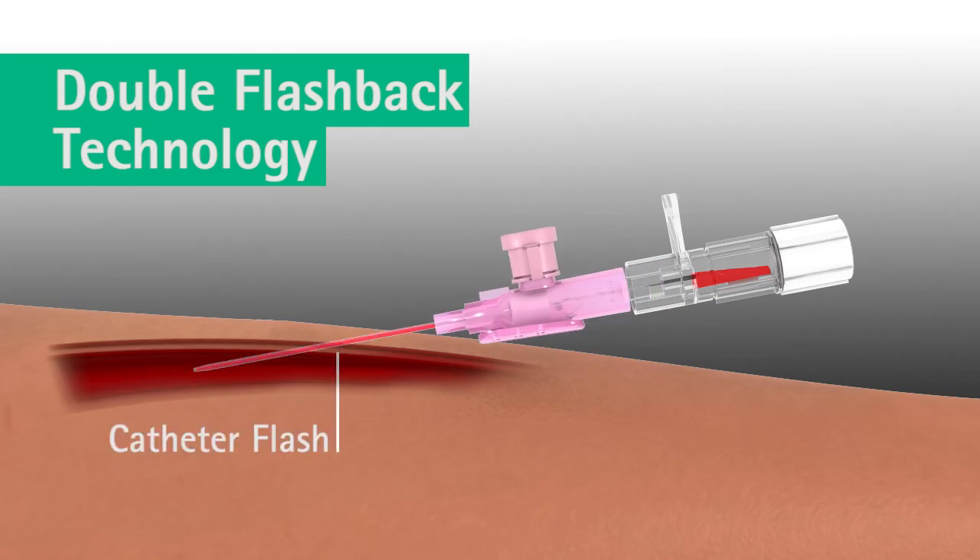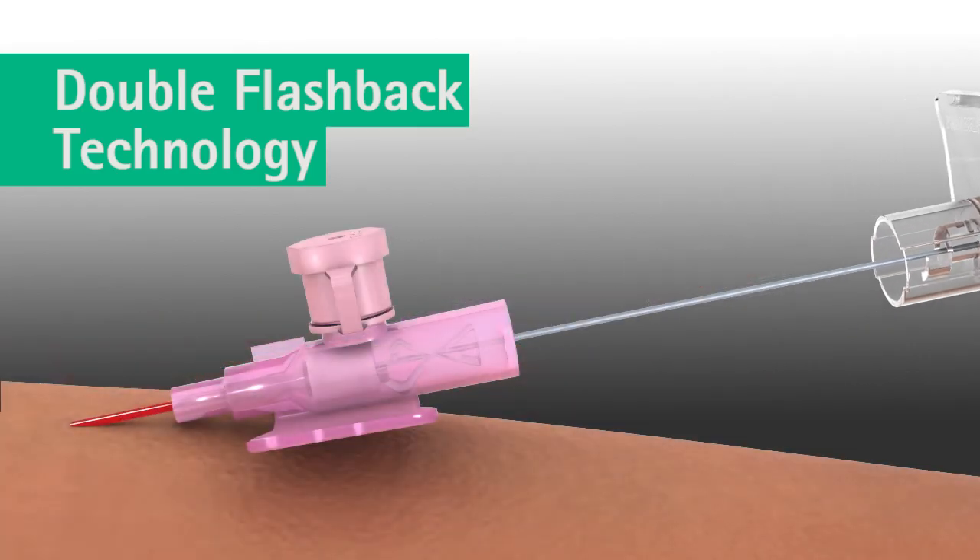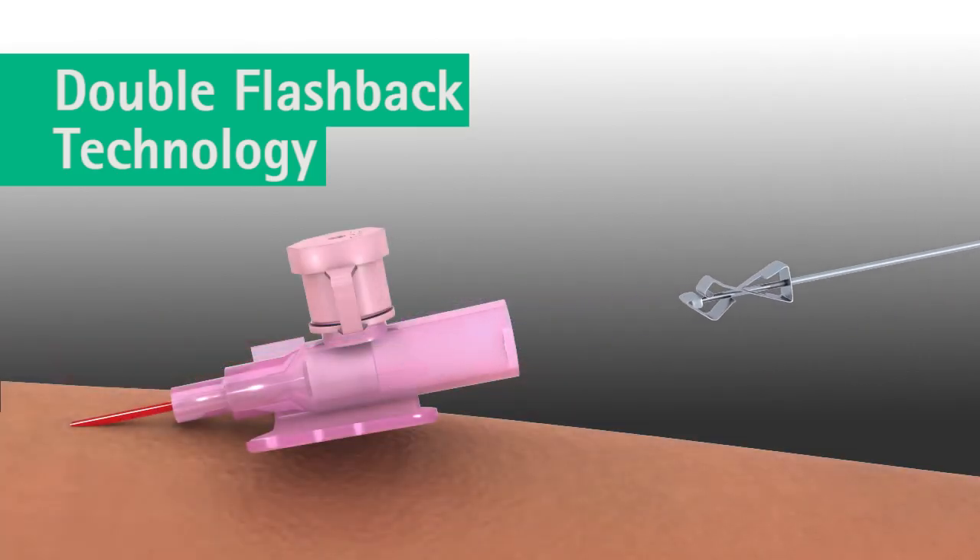As the catheter is advanced, a second flashback — catheter flash — occurs between the catheter and the needle, confirming that the catheter is successfully in the vein. Once the catheter is advanced completely, the needle is withdrawn in a swift, continuous motion.